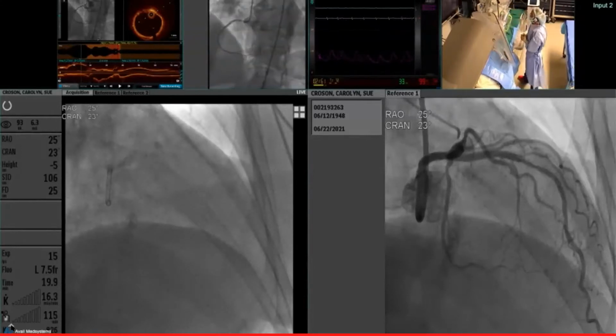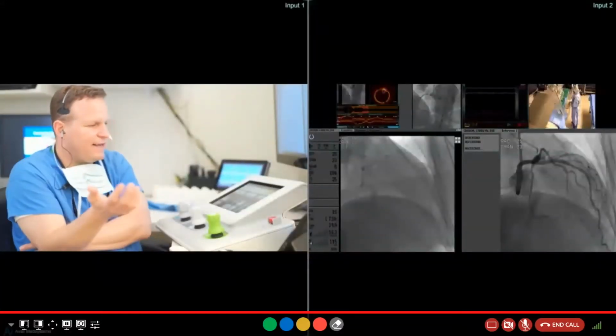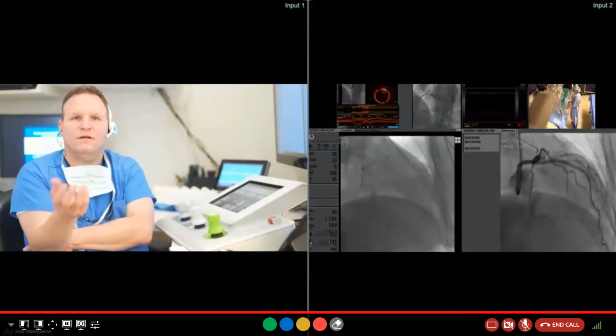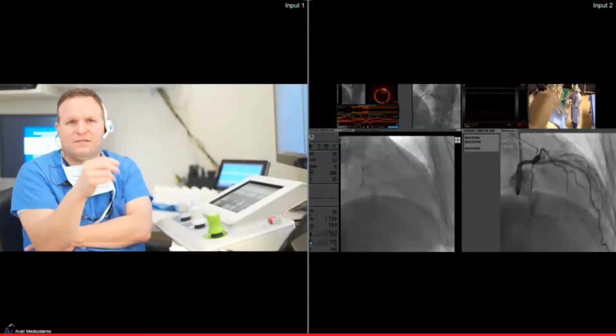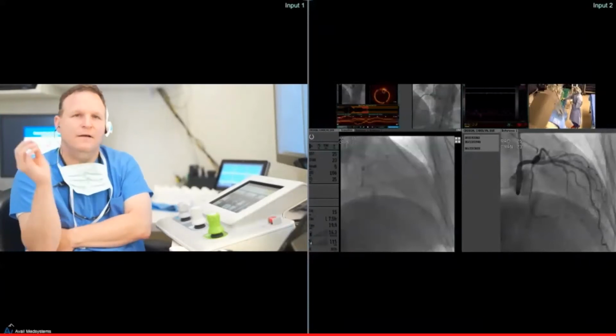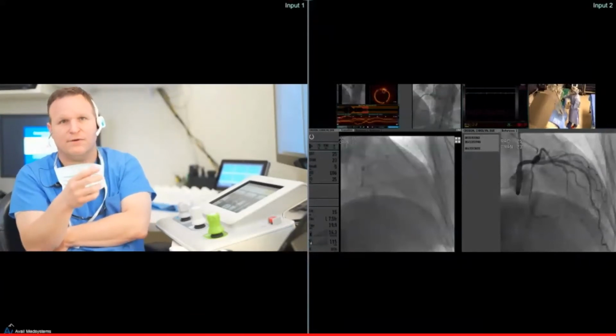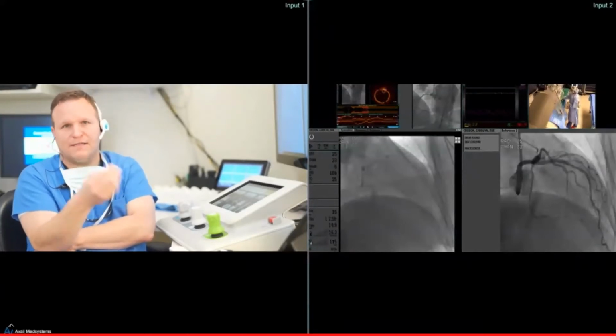I'll go back to reiterate that this is a technology of the future that we're using today, but the part that shocked us was when you asked about the 2 wires. I'd argue there's no more complicated case in all of intervention than a difficult chronic total occlusion. In that situation, we tried the robot, but the reality is there's still such a tactile component that we would do the case and complete it manually. We were involved in a trial with this at several places around the U.S. that had robotics and high volume CTO operators.